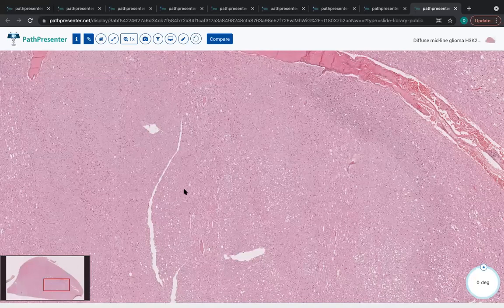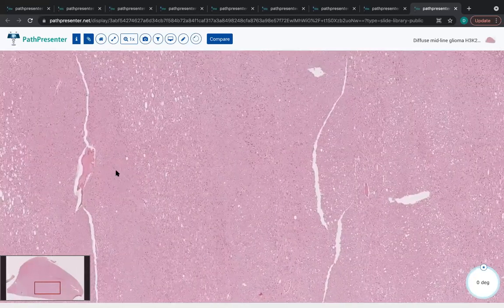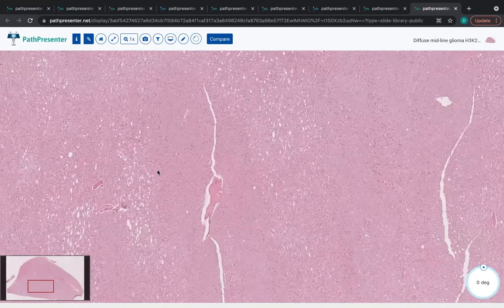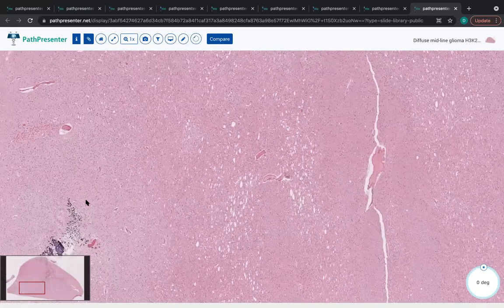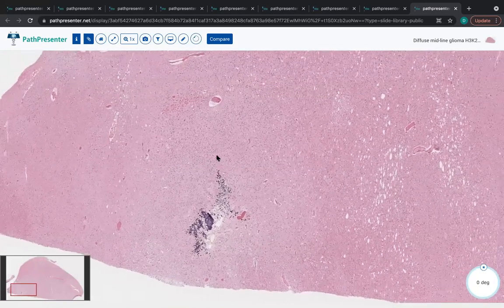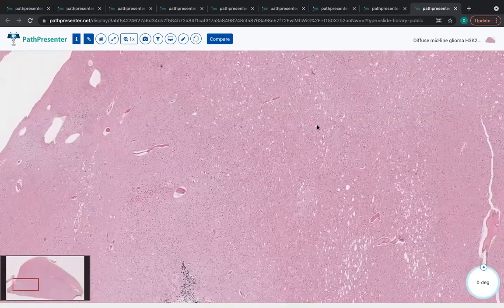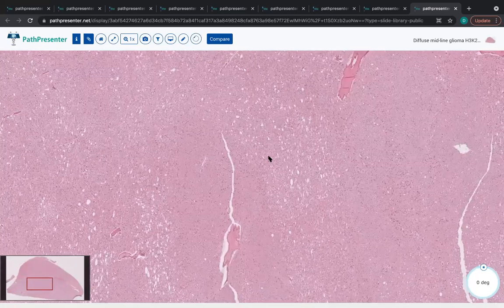designation. And I don't have a good example of the adult counterparts, but many of those that occur in the thalamus and other midline structures are essentially indistinguishable from conventional glioblastomas. So if one does not have those antibodies easily at hand, but we still see high-grade glial morphology on the slide, it's just fine to diagnose it as such, as long as they're either not graded lower than grade 4 or just not graded at all.